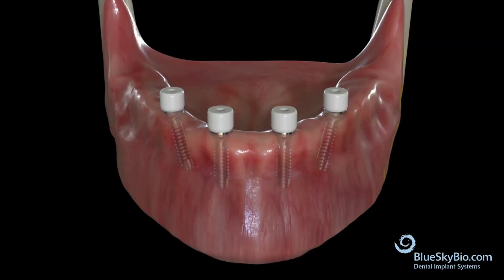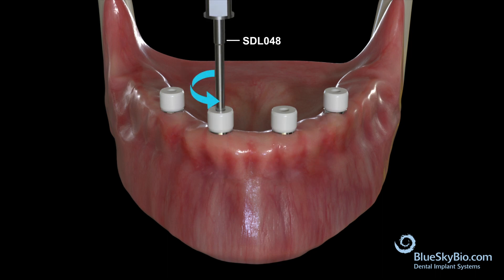This video will demonstrate the restorative process for making a full arch restoration on multi-unit abutments or multi-unit implants. The restorative process can begin once the implants are fully integrated.